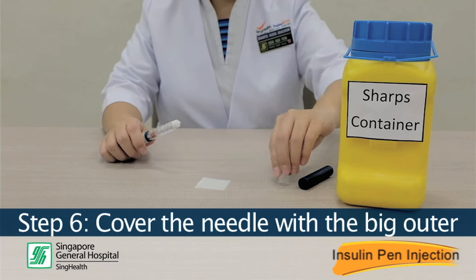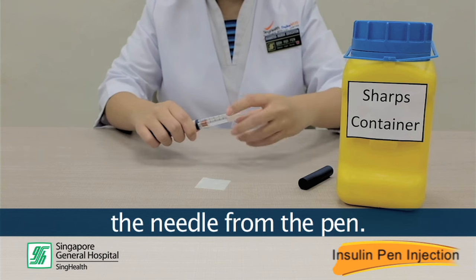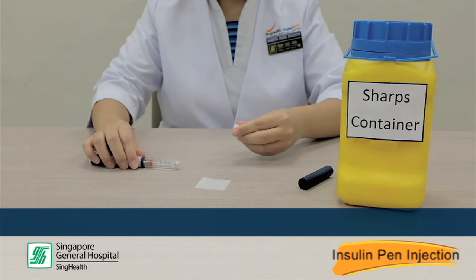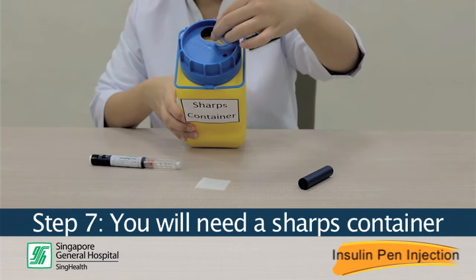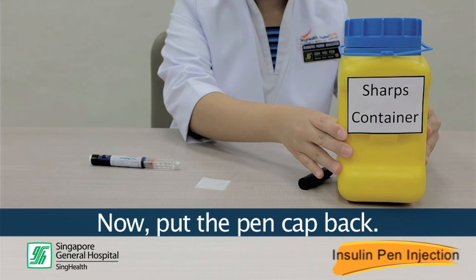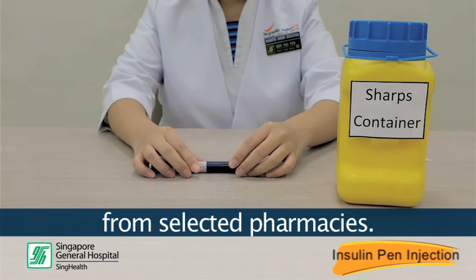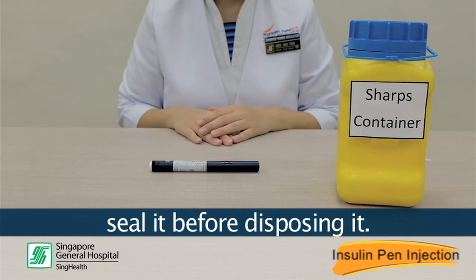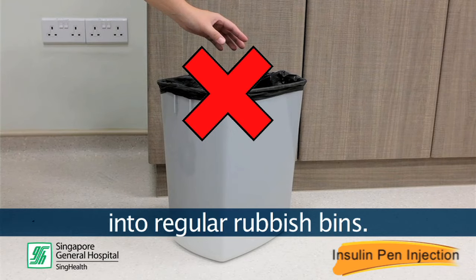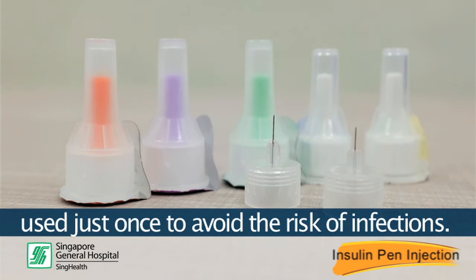Step 6. Cover the needle with the big outer needle cap tightly and use it to unscrew the needle from the pen. Step 7. You will need a sharps container to discard the used needle. Put the pen cap back. You can purchase a sharps container from selected pharmacies. When the container is full, seal it before disposing of it. You must not discard used needles into regular rubbish bins. Insulin pen needles are only meant to be used just once to avoid the risk of infection.